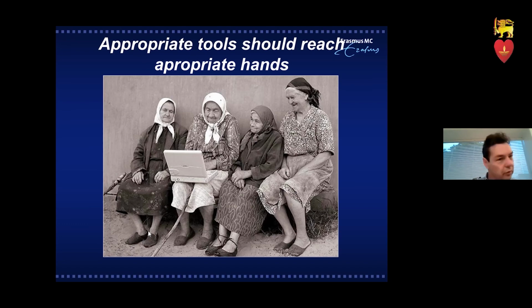So that would be provisional for the side branch, 2 millimeters. If in doubt, control with an FFR, and then go up for the second stent in that situation. The tapering, you have to really look at your tables. And there are 2 publications, I think the last one was in the International Journal of Cardiology, on overexpansion of your stent.